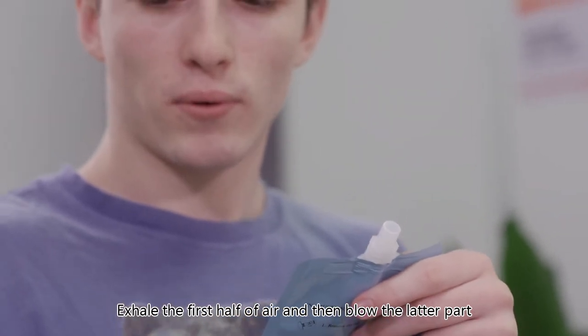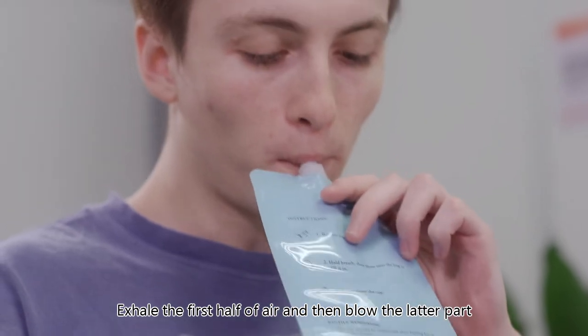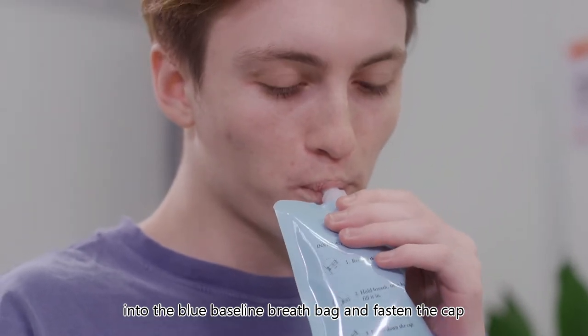Exhale the first half of air, then blow the latter part into the blue baseline breath bag and fasten the cap.